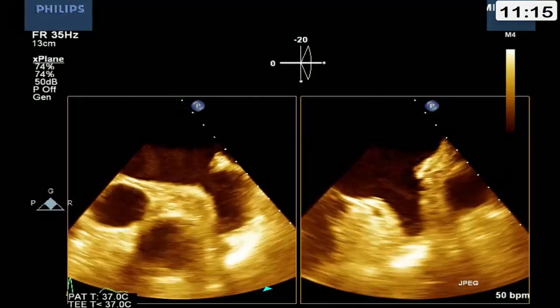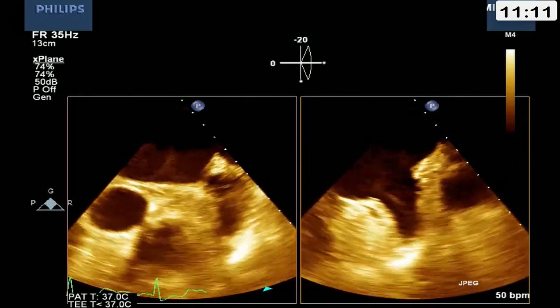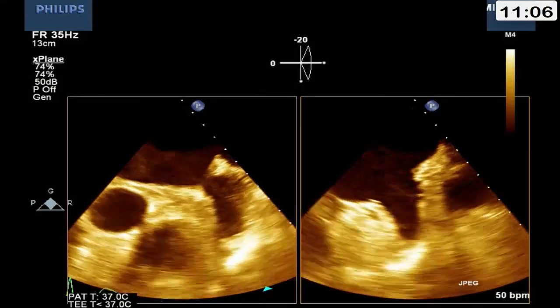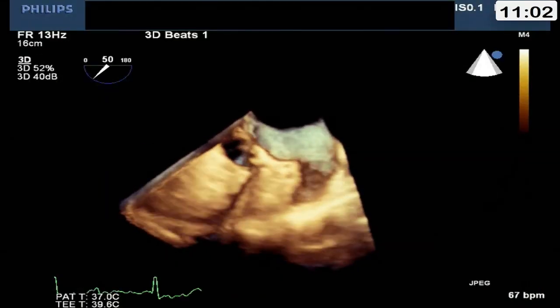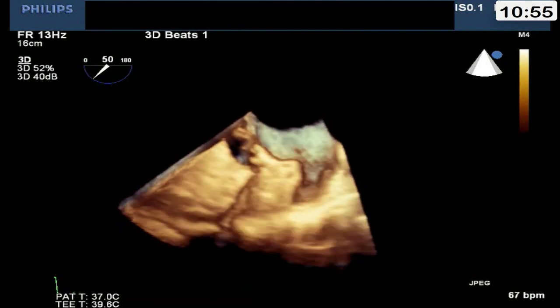So moving on, this is the left atrial appendage, and when your atrium is not contracting, you make a smoke, and sometimes you make a clot. And yes, I agree, sometimes you're not sure unless you do a 3D. If you move to 3D, you can find this very nice thrombus, like a tongue moving here, waiting to displace itself in the brain and give the poor patient a stroke.